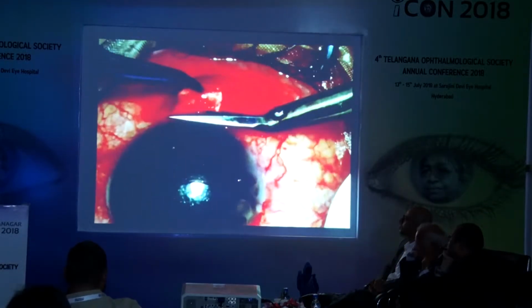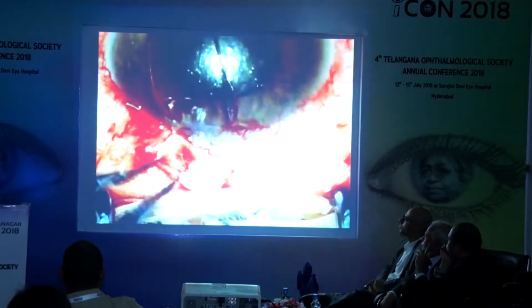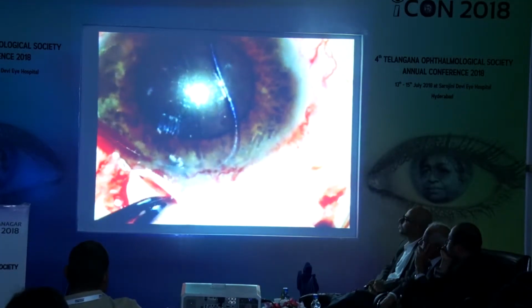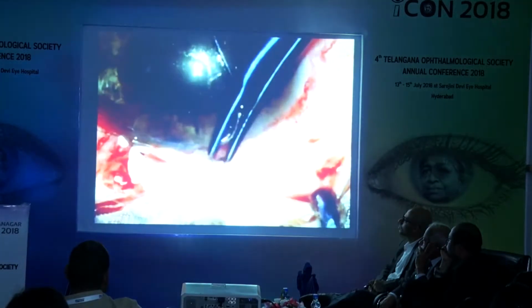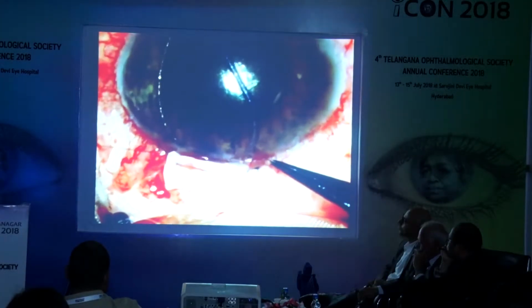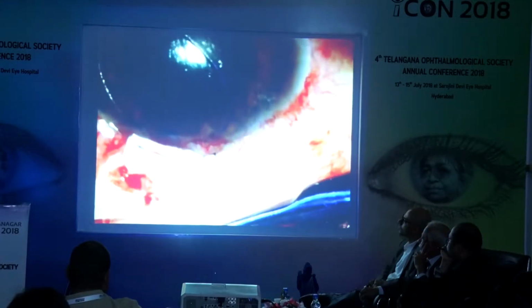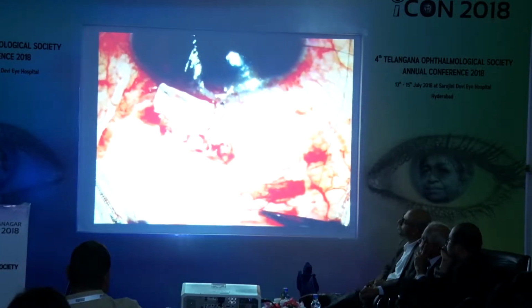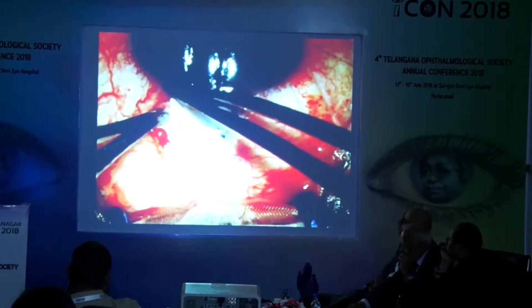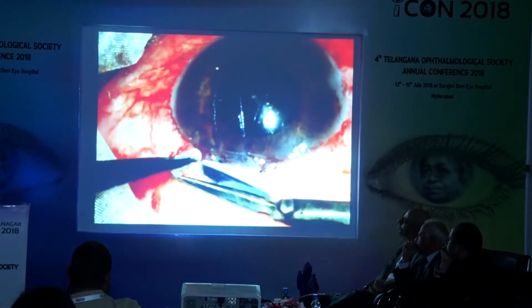This was then placed over the scleral bed and sutured with 2 interrupted 10-0 nylon sutures at the limbus. A mattress suture was also placed across the breadth of the scleral patch graft at the limbus. Posteriorly, 2 interrupted sutures were placed at the 2 corners of the graft. The ragged conjunctival edge was cut and regularized.